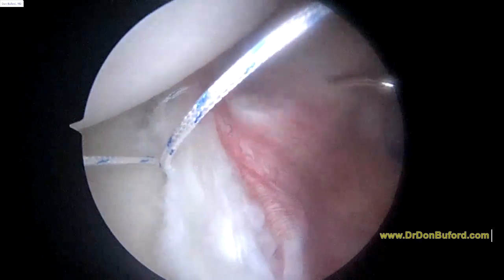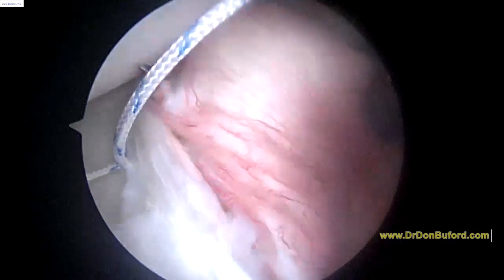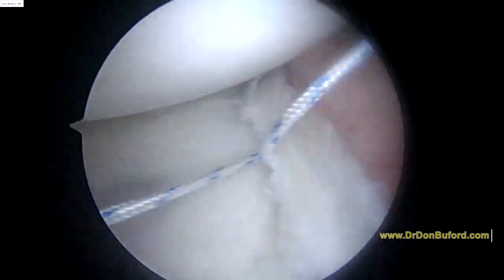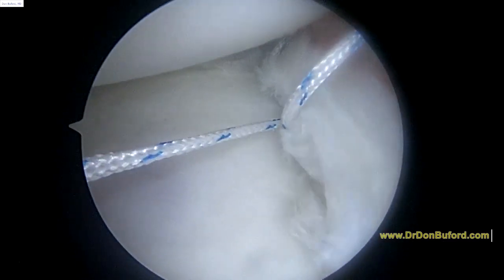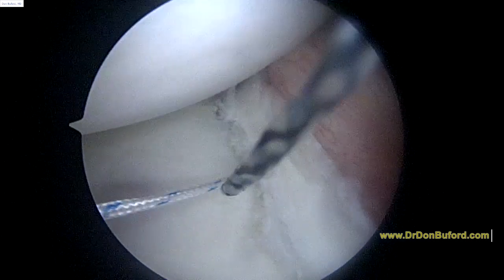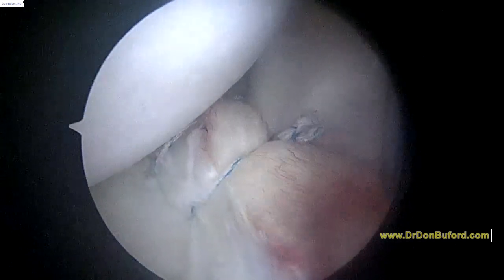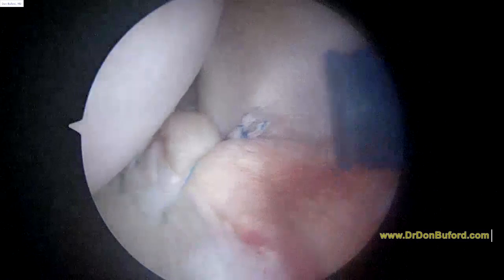How's our systolic doing? Is it good? There's the first pass, and now we'll go underneath the labrum here. I think that'll be fine. We'll feed that through. Okay, so the second one's tied. You can see this wasn't quite the same type of figure eight mattress stitch. This was a simple stitch, and it looks good.